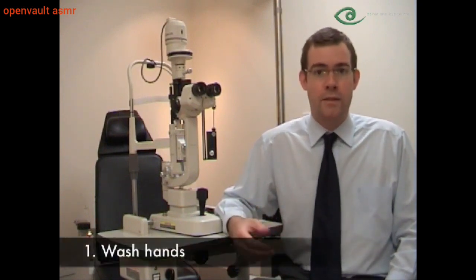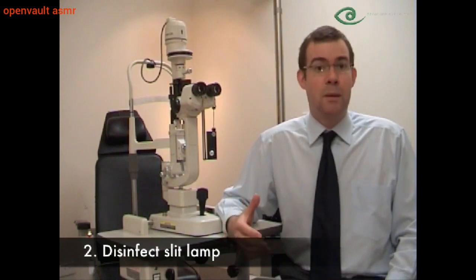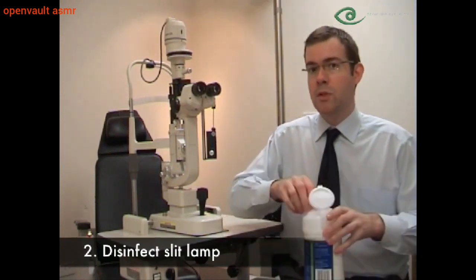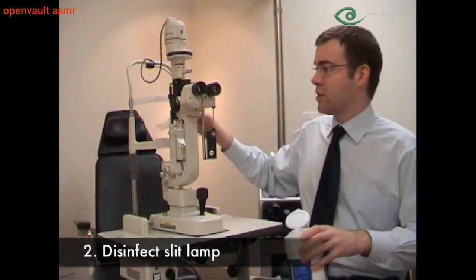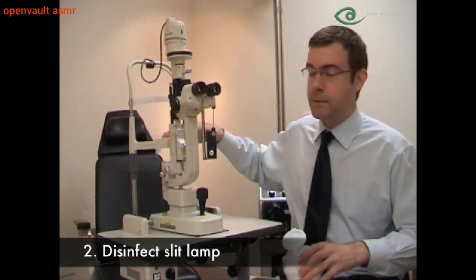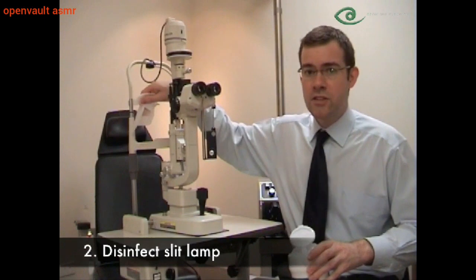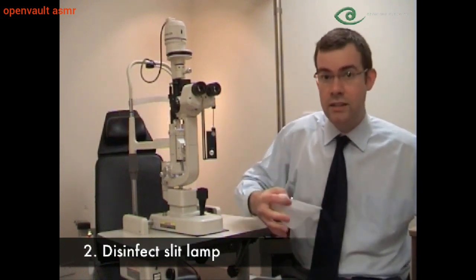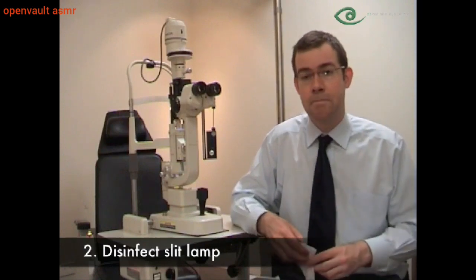This section describes the steps involved in a basic slit lamp examination. The first step is to wash and dry your hands thoroughly. The next step is to disinfect the slit lamp, which should be done between each patient. At minimum, use an alcohol wipe to clean down the chin rest and the forehead bar. If the last patient had an infectious condition such as viral conjunctivitis, the entire slit lamp should be disinfected.